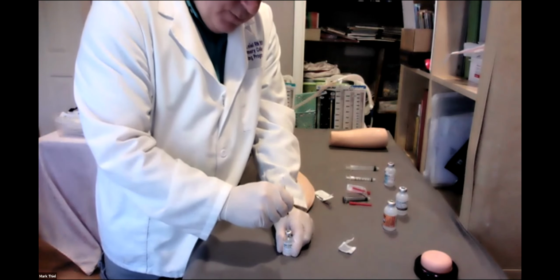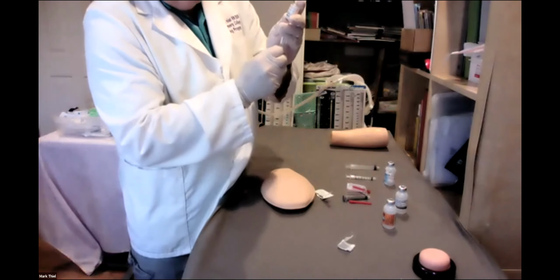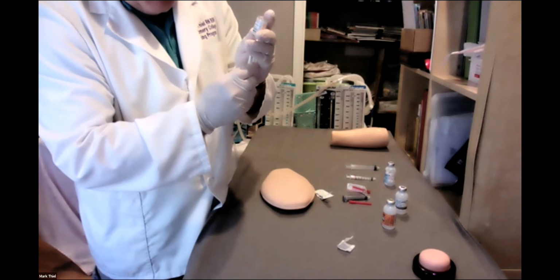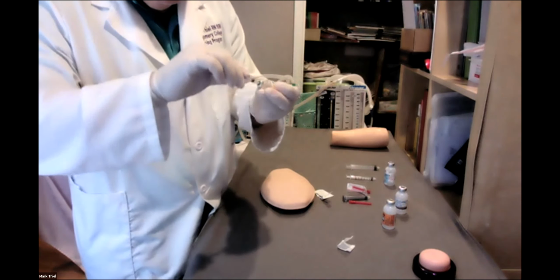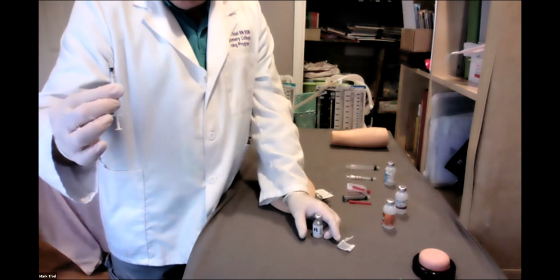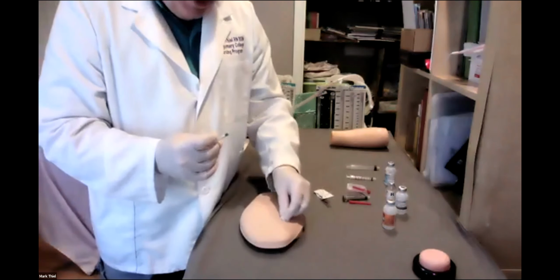Vial down, inject. What was it before, folks? Up, draw the tiny amount of it, handle bubbles, just the way we talked about. Withdraw, hand to a nurse check for a second check, and here we go.